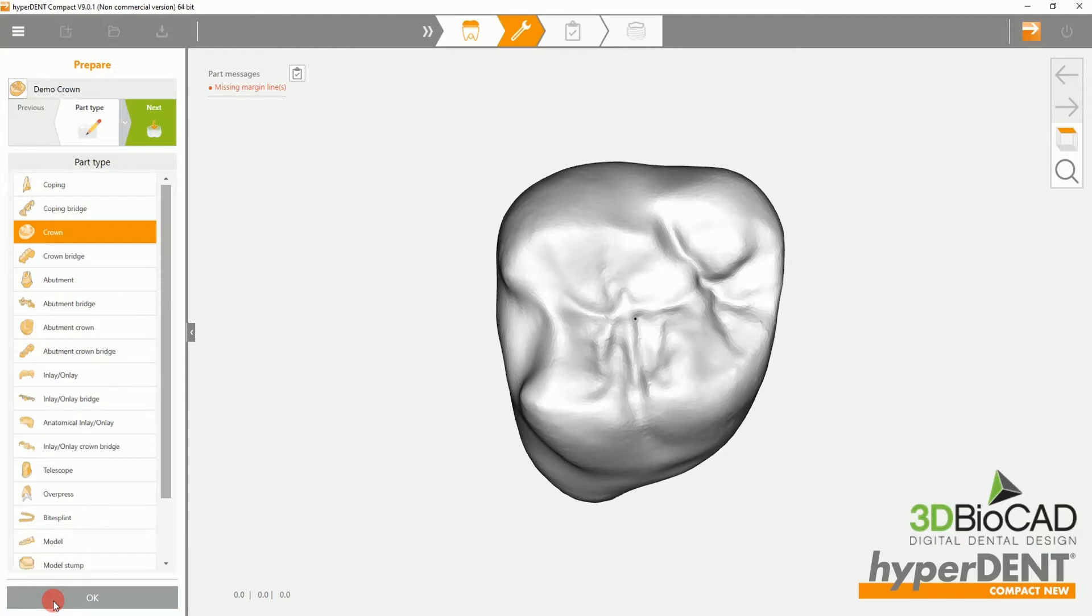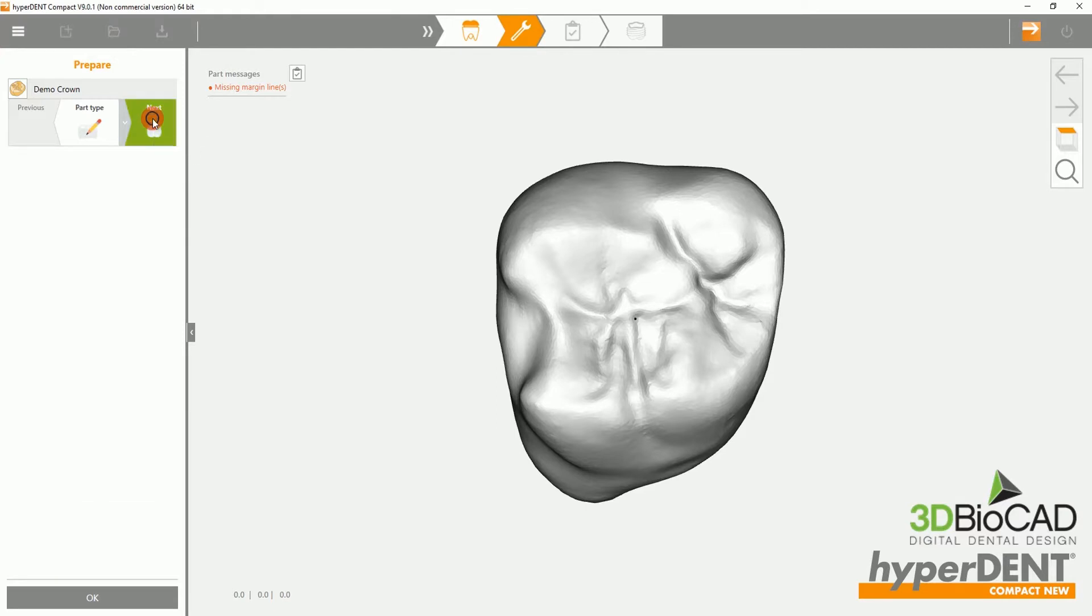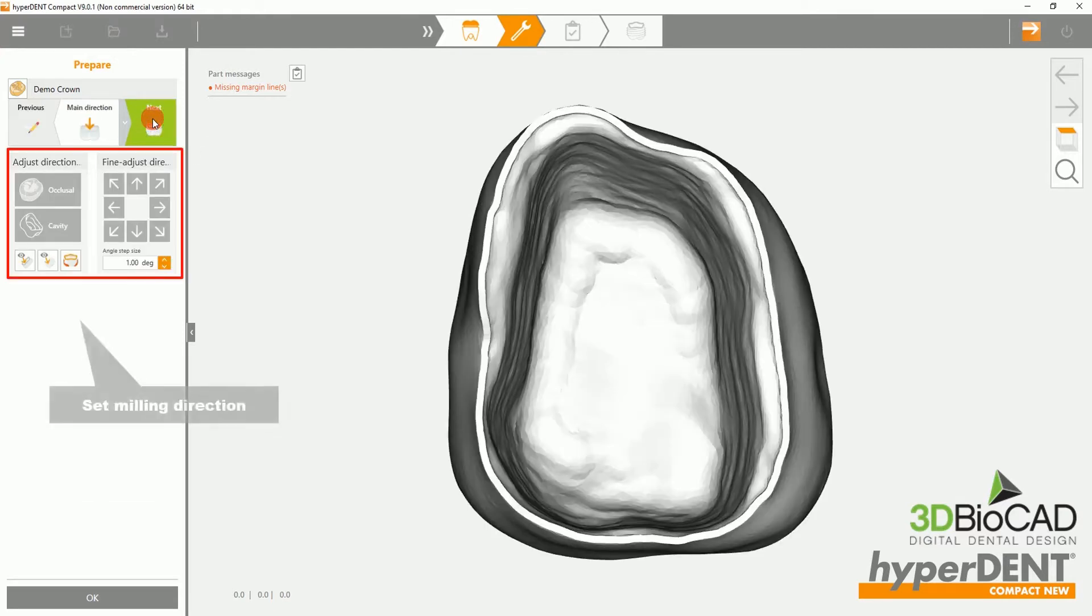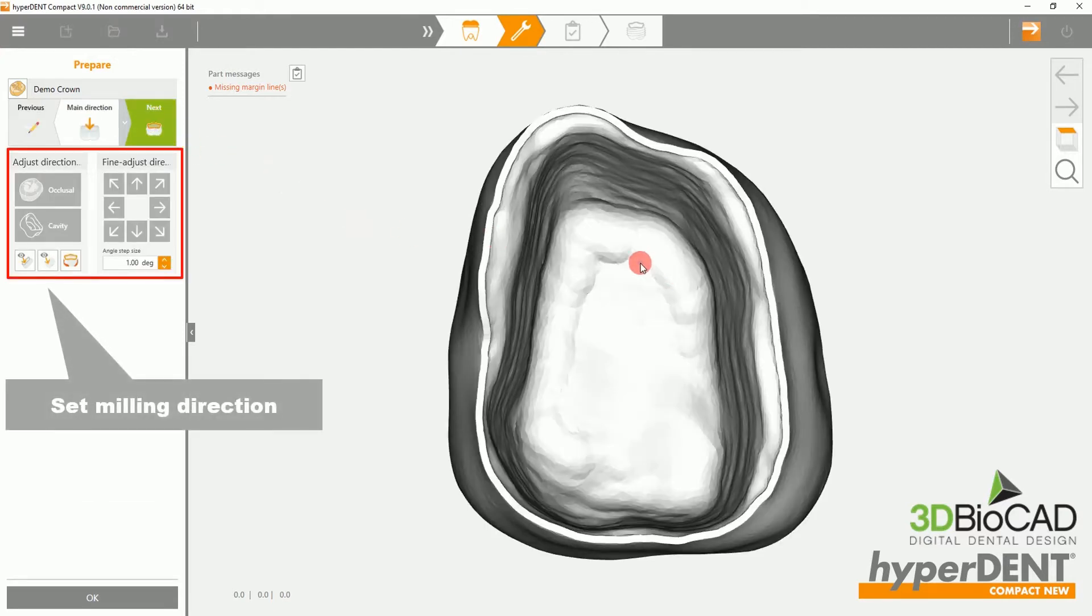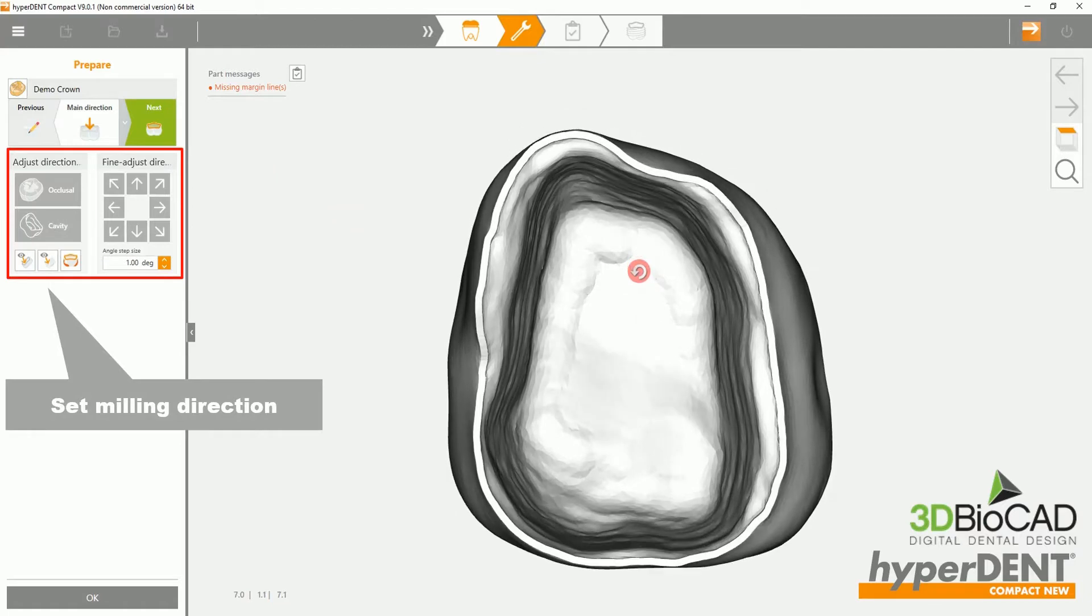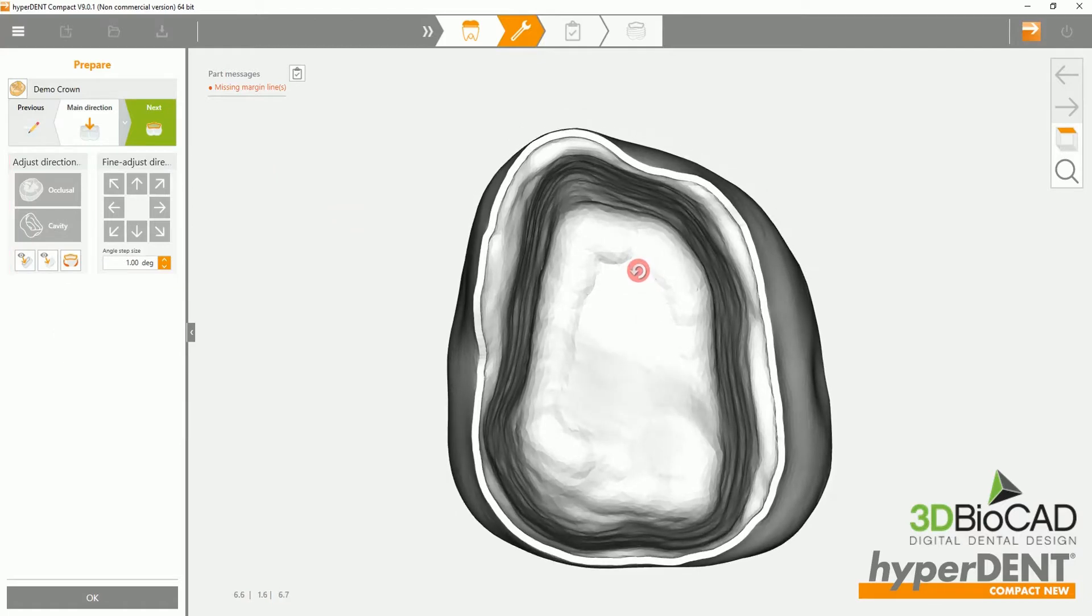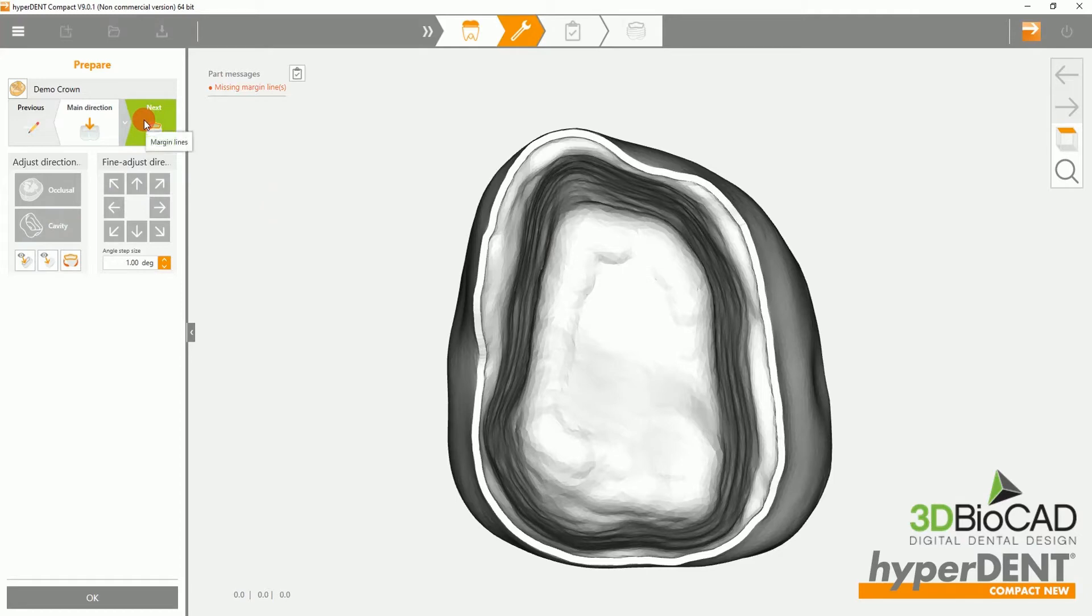On this page, you can double-check the part type you've chosen. Next, you will be setting a milling direction. Please select the cavity option, then click next.